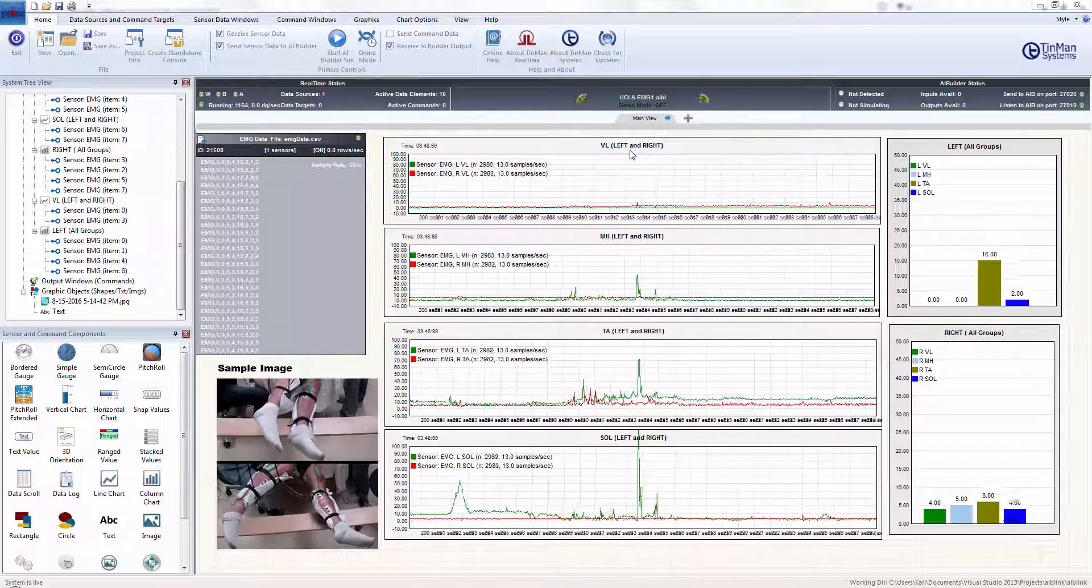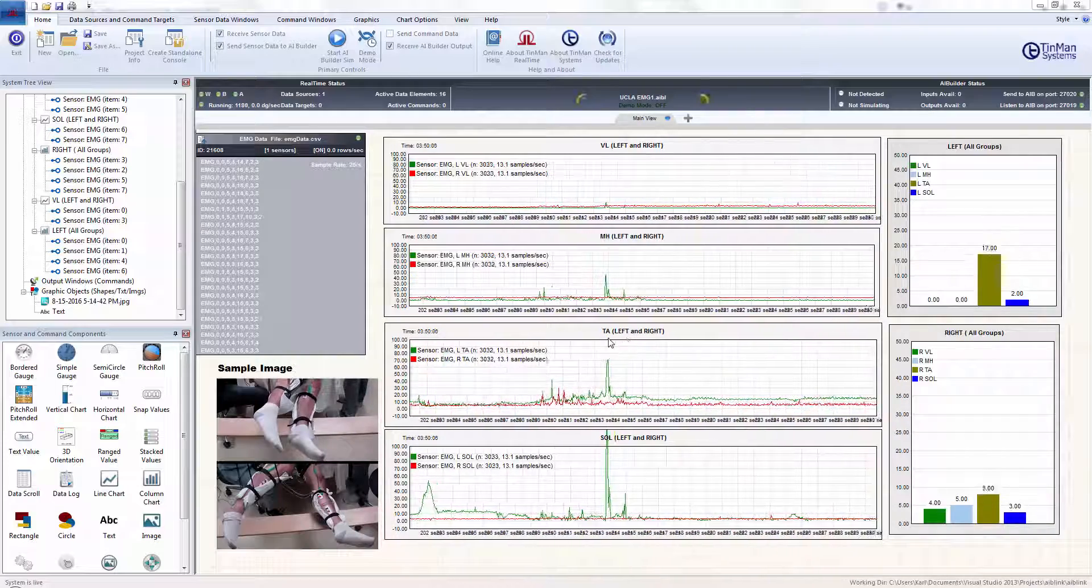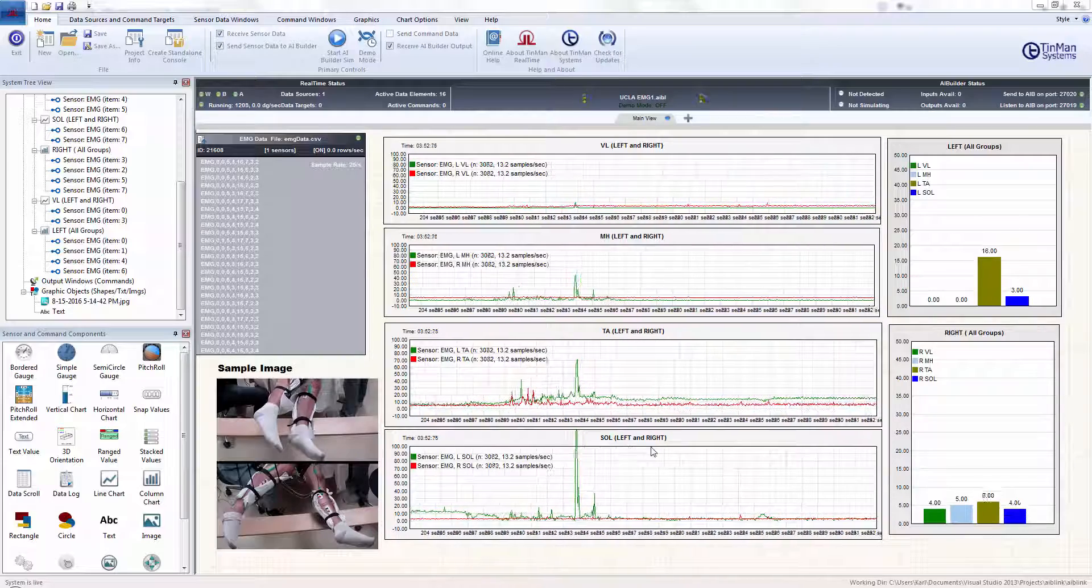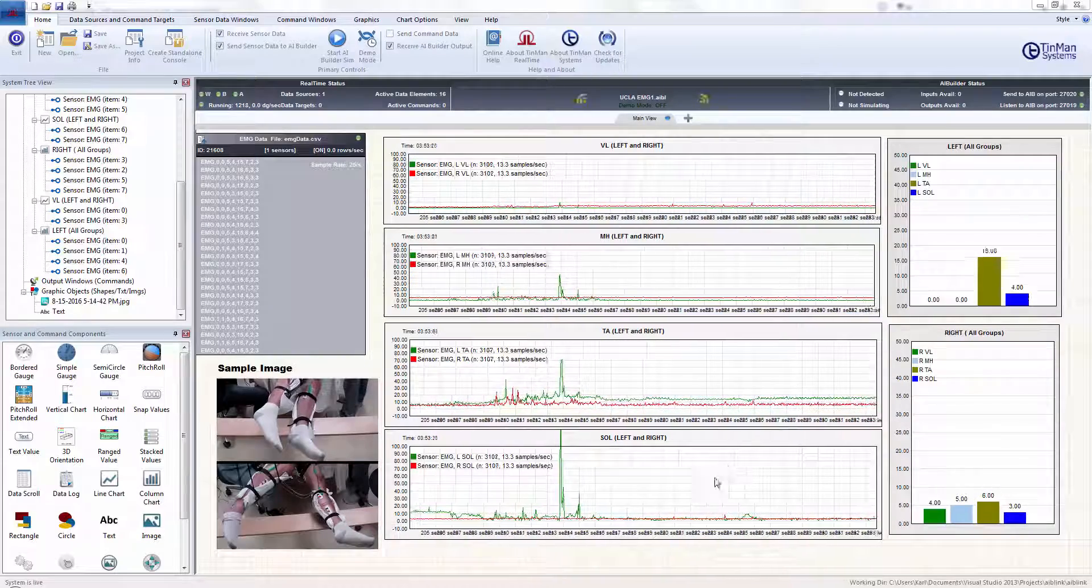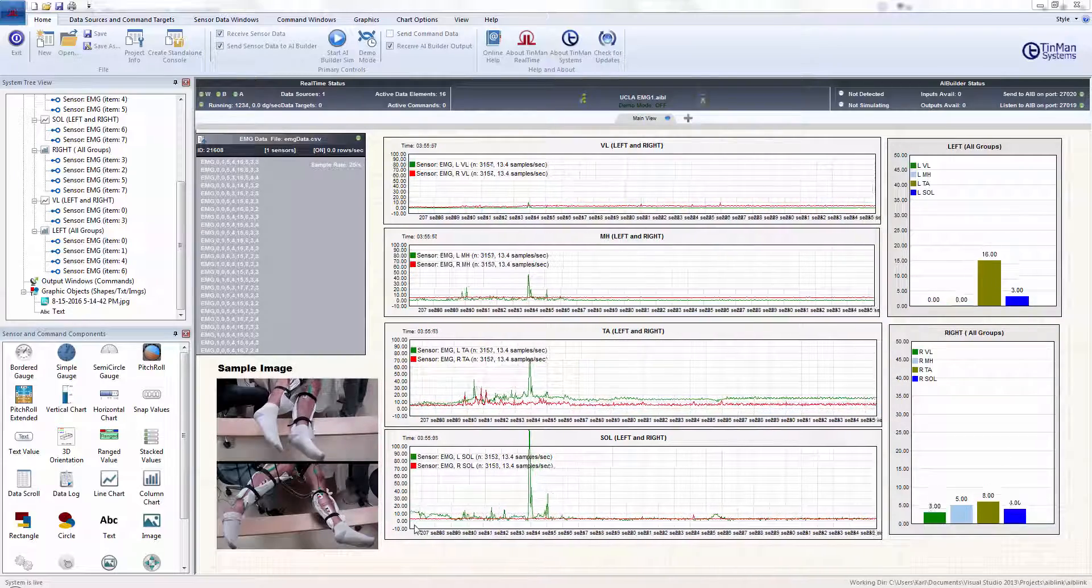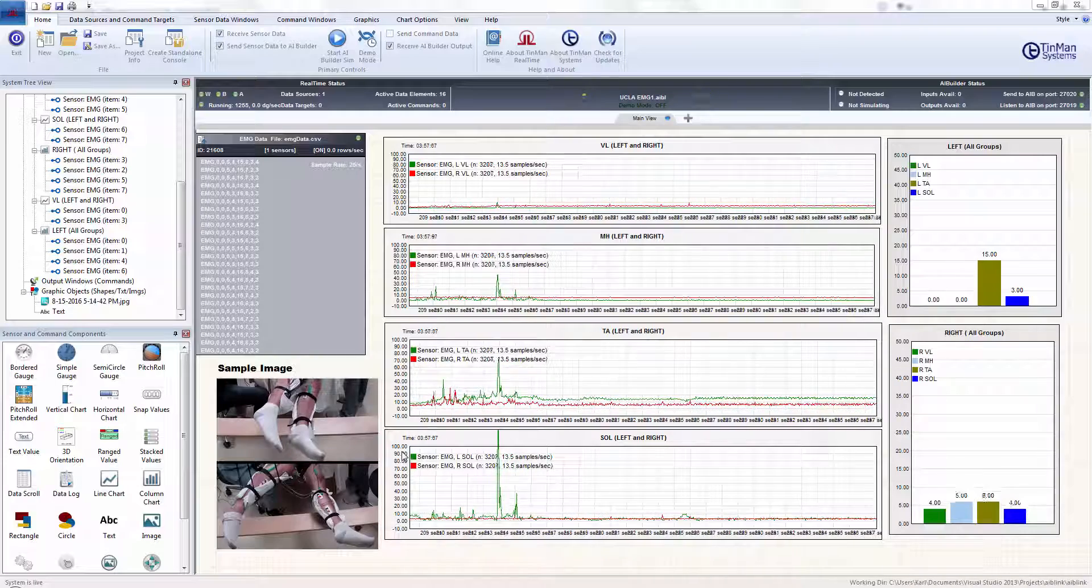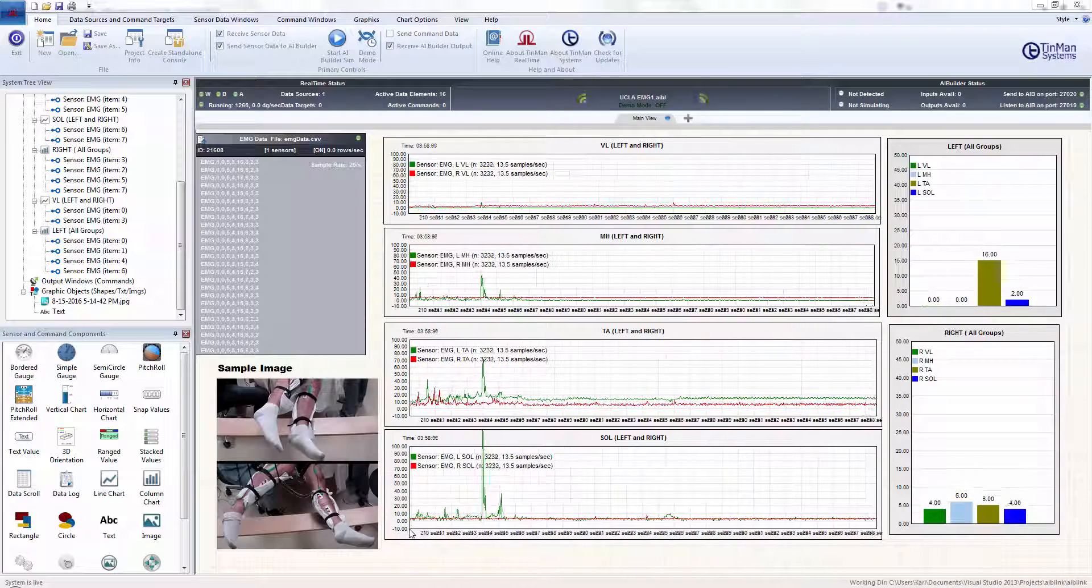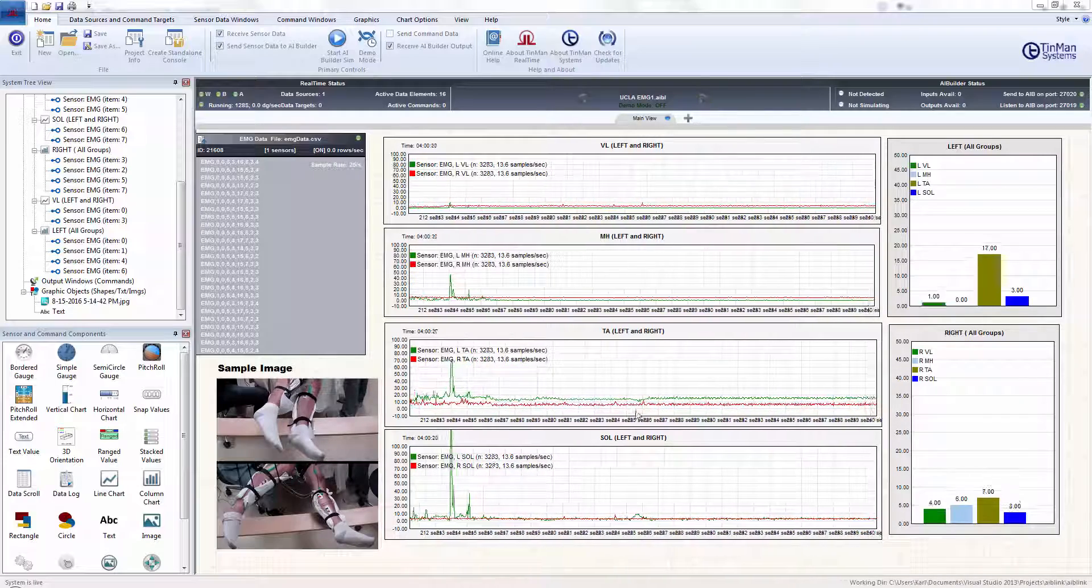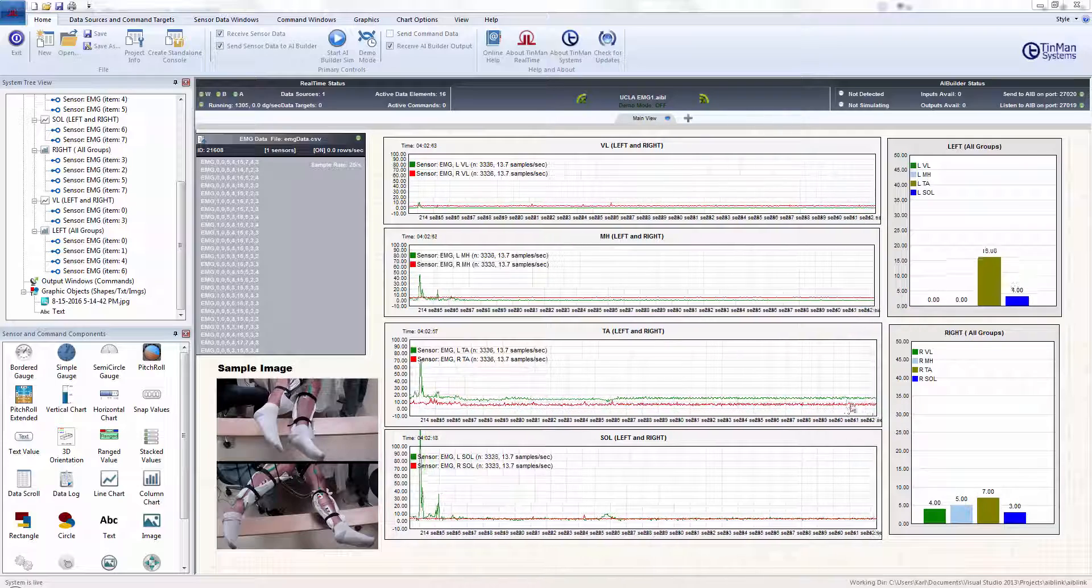And so we have VL left and right, MH left and right, TA left and right, and SOLUS left and right. We're going from a scale of 0 to 100, but I'm starting out at minus 10 so we can see the deviation below zero.